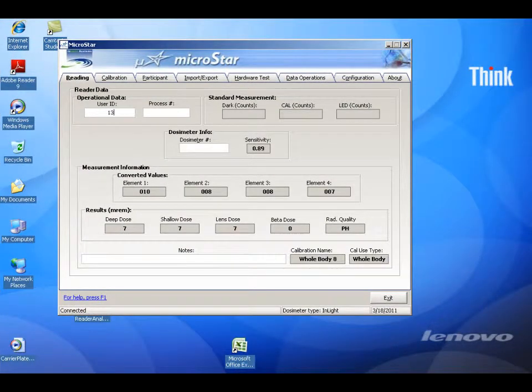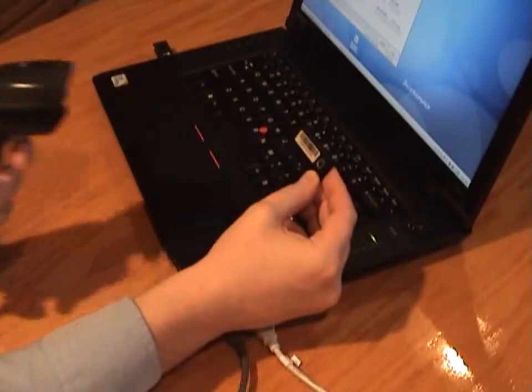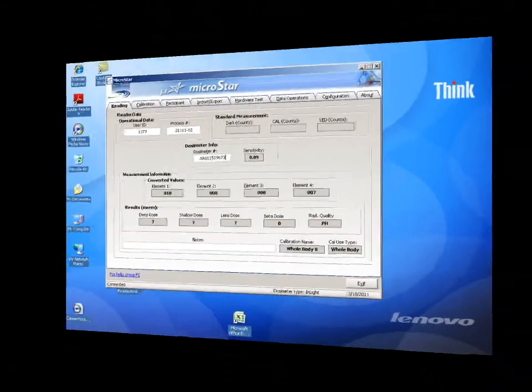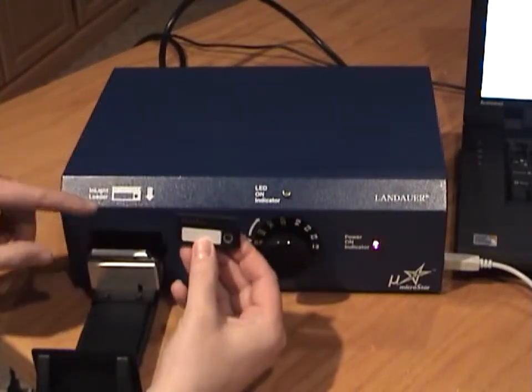The operational data is optional, but you can enter a user ID and a name for the group of the badges that you will be reading. Place the cursor onto the dosimeter text box, then scan the dosimeter serial number. Place the dosimeter into the reader drawer nest. The correct orientation is diagrammed on the front of the reader.